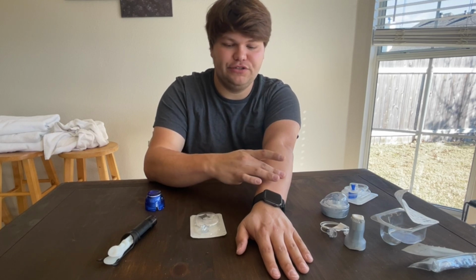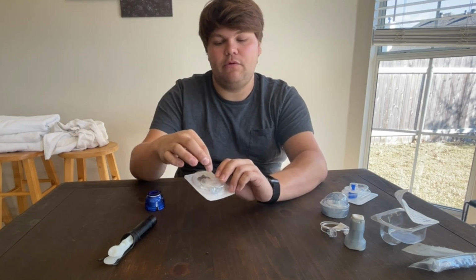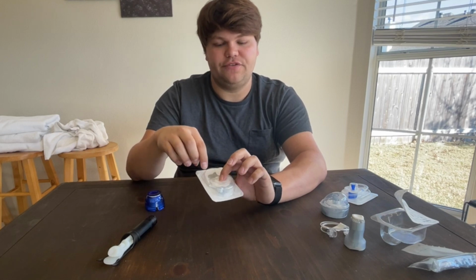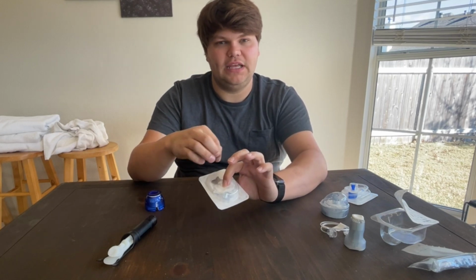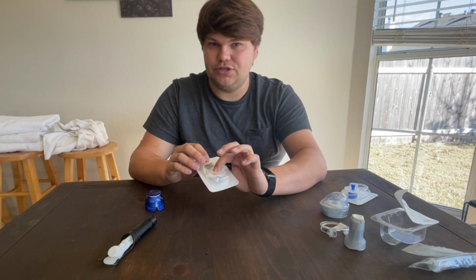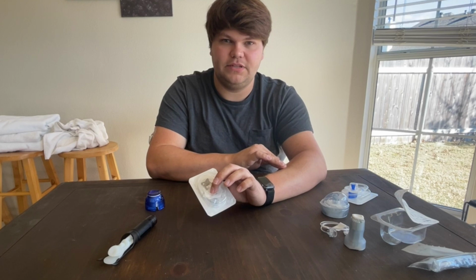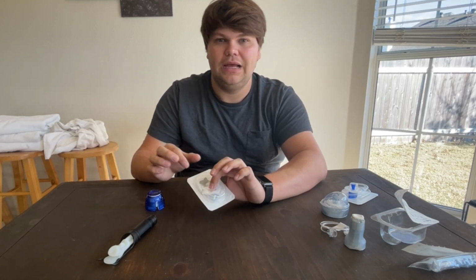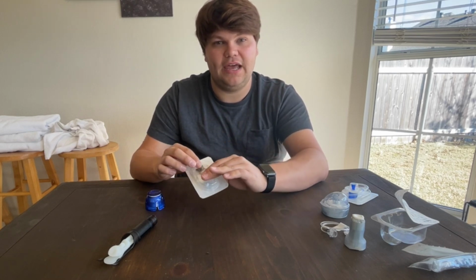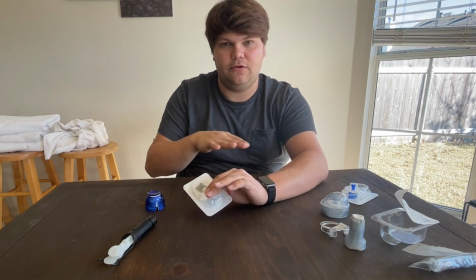You do the front one first, then you're gonna remove the dark gray piece. It's just a pinch and pull. That will remove the needle from the cannula. Once you've done that, then you can place your finger on the front of the infusion set and remove the adhesive on the back side and get that nice and flat. You do not want to, trust me, I've done this, put all the adhesive material down and then try to remove the needle. That will hurt slightly, so that's why I said you want to do the front just to keep the infusion set down, pull the needle out at an upward angle, and then bend the infusion set down and put that rear adhesive on.